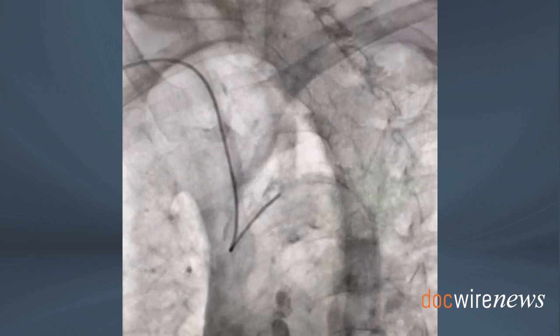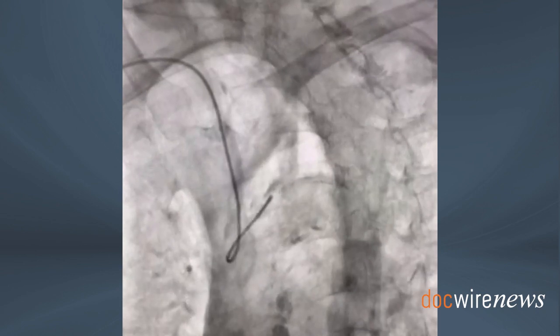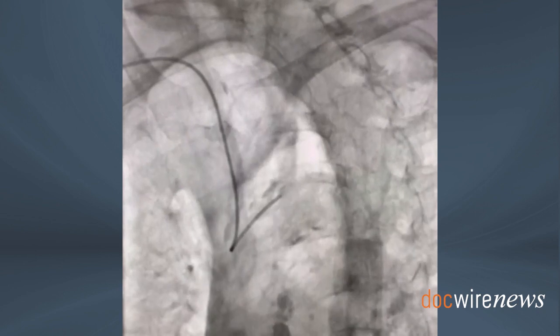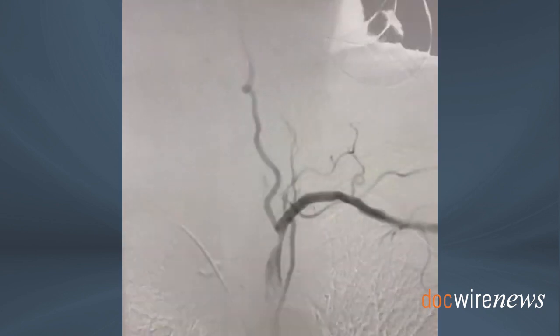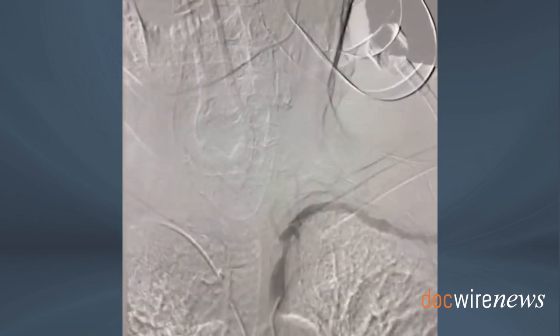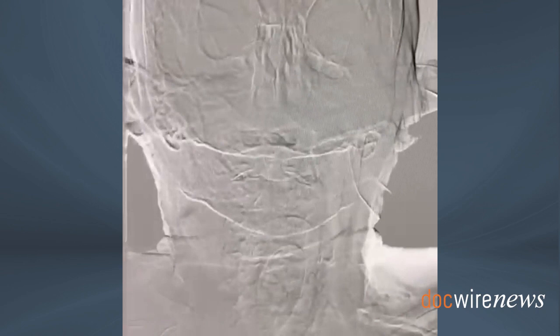In this case, a Simmons 1 reverse curved catheter is shaped in the descending aorta, then is pulled back while being rotated clockwise to try to engage the left subclavian artery. Notice the slow movement, the puffs once in a while, and the minute details of the catheter engagement. We get a left subclavian angiography, which reveals a severe proximal left subclavian artery stenosis, causing slow flow in the antegrade vertebral artery and subclavian steal physiology with intermittent transient reversal of flow from the vertebral artery.